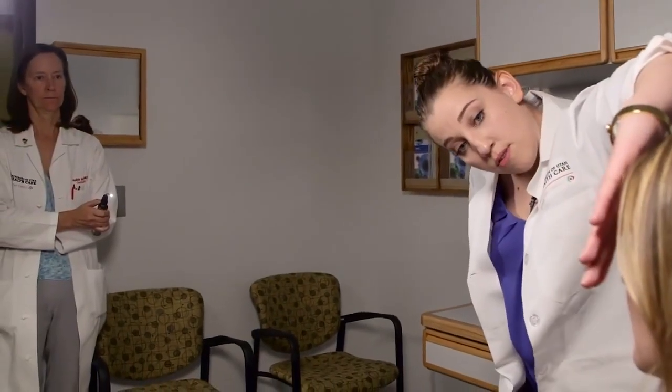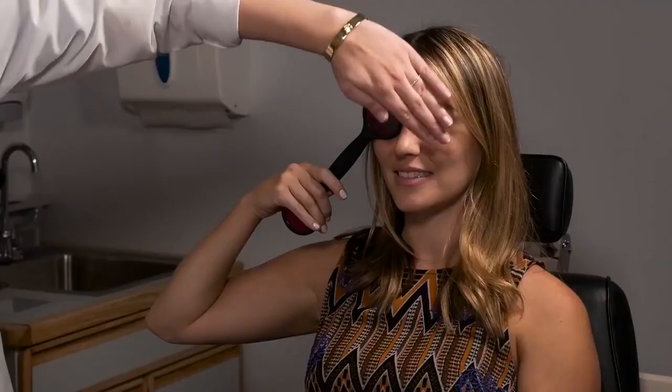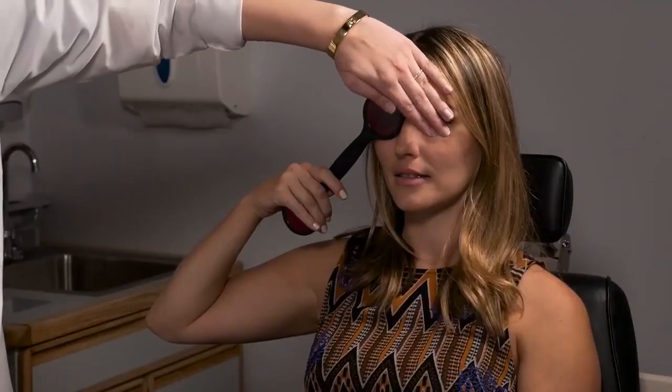And you have your assistant hold a muscle light down at the end of the room. So can you appreciate that there's a horizontal red line when you're looking through your right eye? Yes. Yep, and you can kind of rotate that to make it perfectly parallel with the floor. Okay, so when you're looking down at that red light, or the white light, sorry, is the white light above or below the red line? Or right on? Right on it. So she's very well aligned. So the light and the line are at the same level.